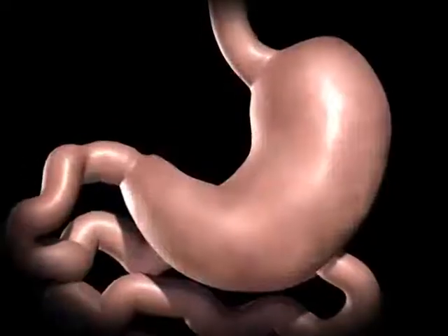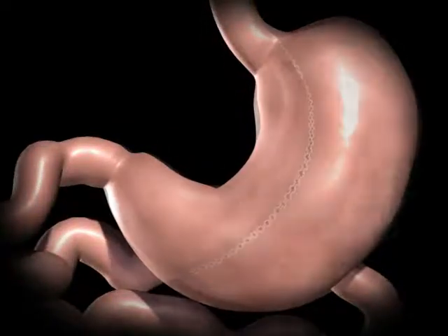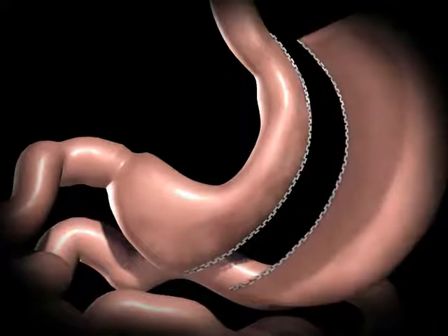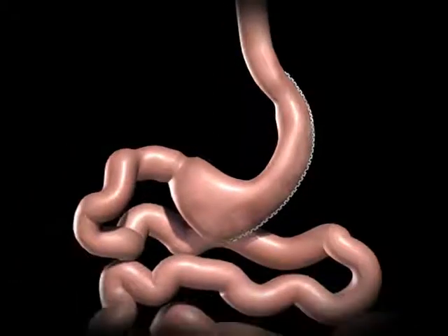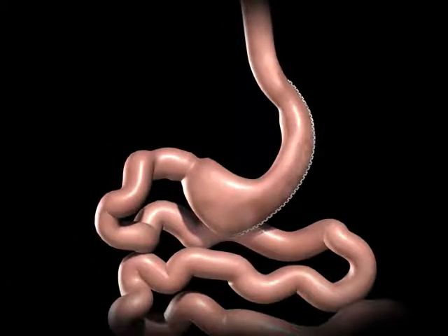During a sleeve gastrectomy, a thin vertical sleeve is created by using a stapling device. The excised portion of the stomach is removed. The new stomach is one tenth of its original size and is about the size of a banana.